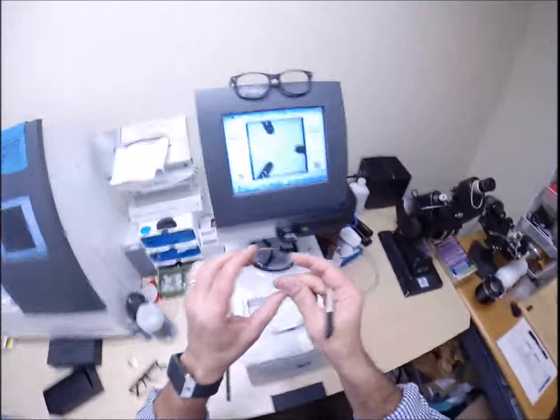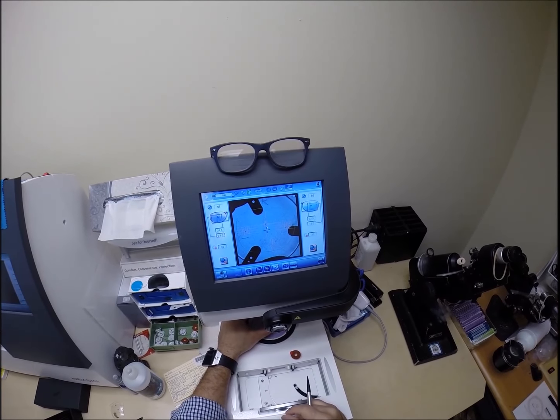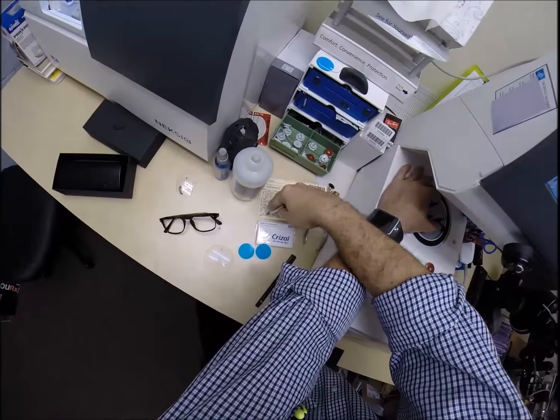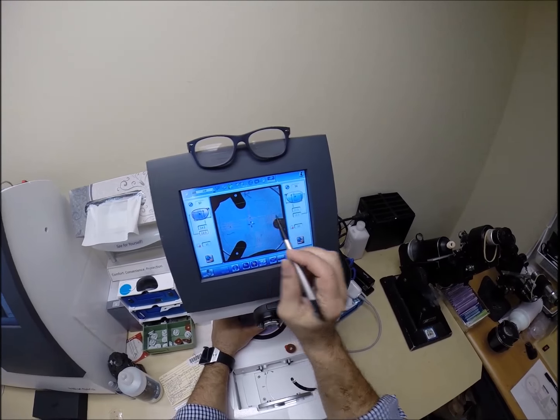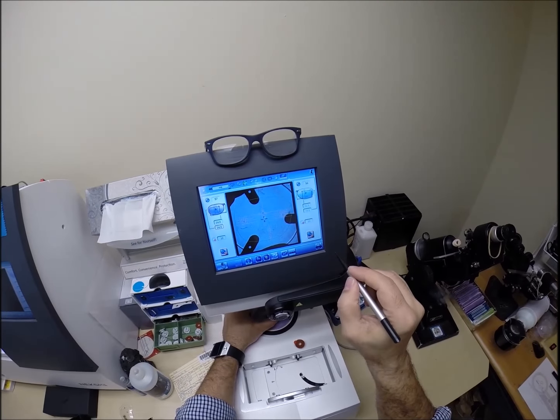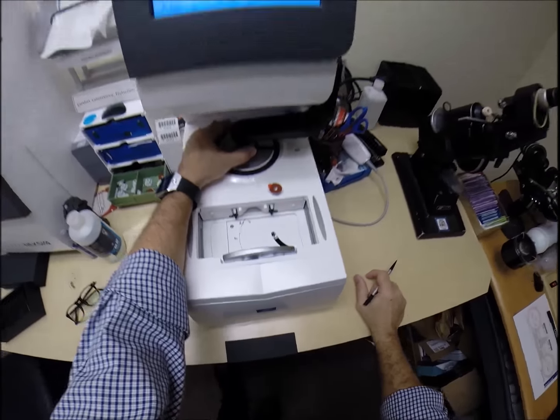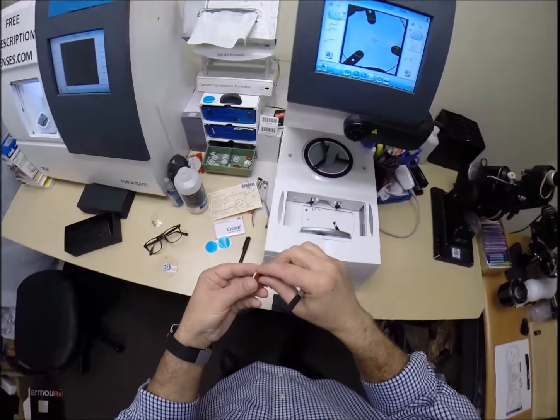I've been doing this all along - I've just never shown anyone before. Usually this is not the final paperwork. I do not put your address, phone number, email, and all that on there, so I make up a second card. I put a sticker on your permanent card so that when you call or email me, I'll have a reference to it. Let's go ahead and put your frame into the tracing element of my blocker and hit start.